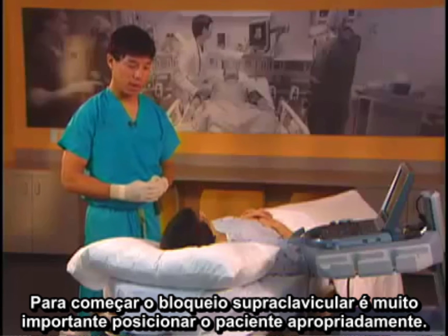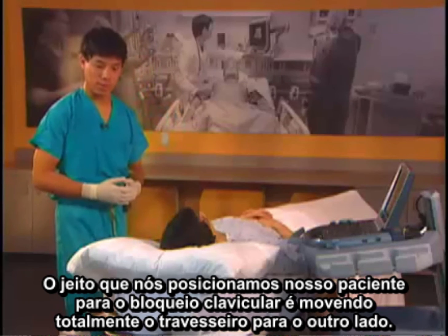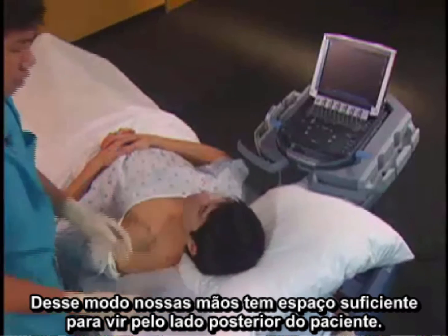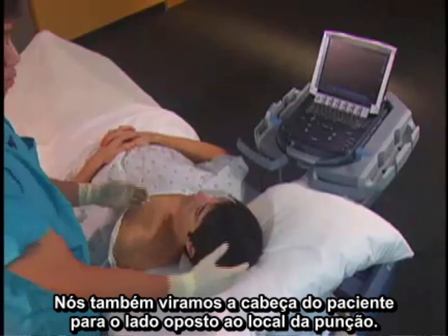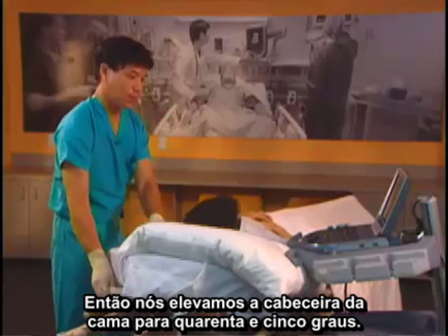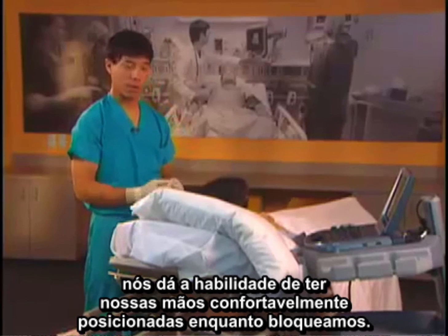To start a supraclavicular block it's very important to position the patient properly. We move the pillow all the way over to the side so our hands have plenty of room to come from the posterior side of the patient. We also turn the patient's head away from the site to be blocked, then elevate the head of the bed 30 to 45 degrees, giving us a comfortable hand position while we do the block.